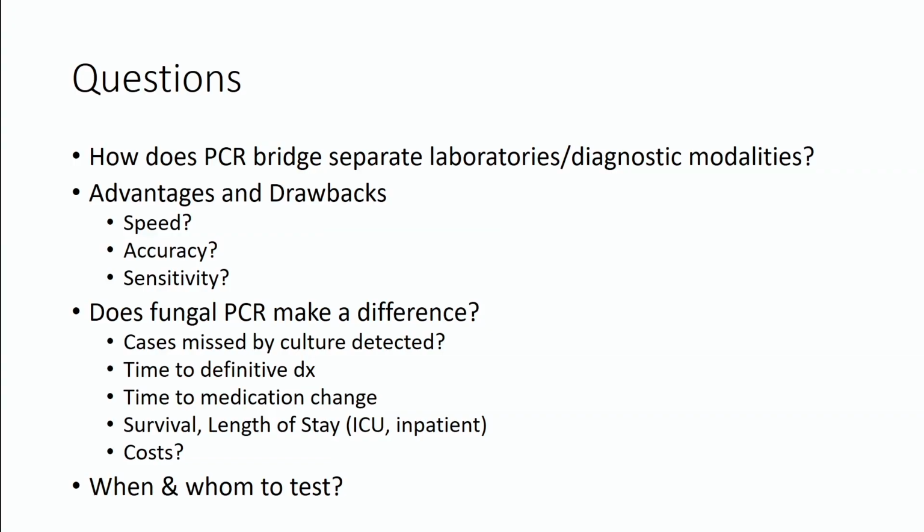So putting all this together, I developed a number of questions that just wouldn't leave me alone about how we can use PCR to really bridge what happens in the clinical lab. As I showed you in that first case, sometimes we don't have an answer for our colleagues on the clinical side of things. And how do we bridge that with what's in the histopathology lab, where often we have diagnostic material?